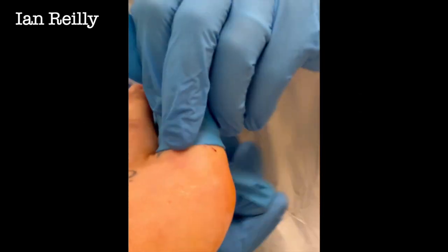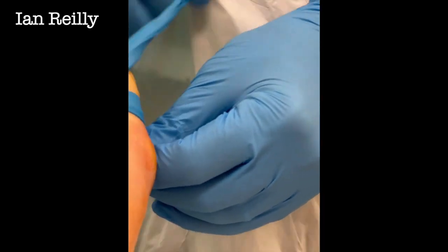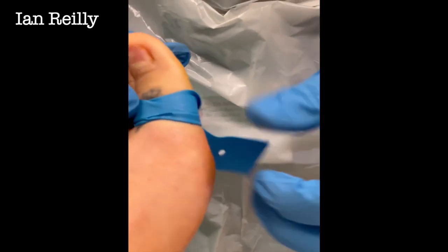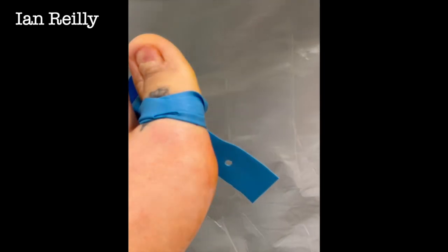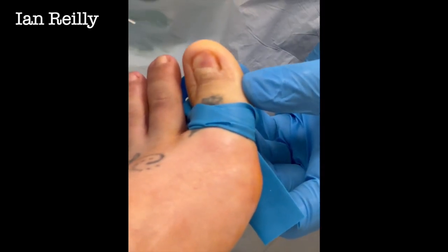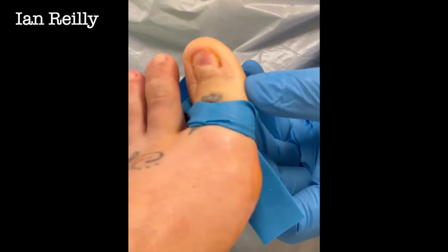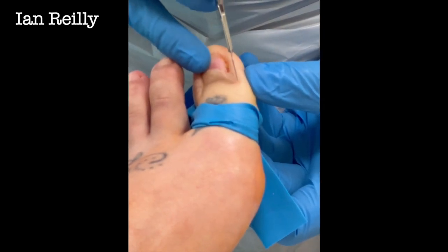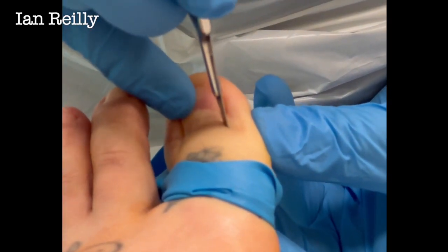We've already prepped the skin before the local anesthetic and re-prepped just then, so she's nice and clean. It's been a clean wound — not infected, just been sore for a few years. I'm just going to test again — any sharpness at all? All nice and good. Our root will be coming back here. There's our previous scar, so you want to make sure you're coming back far enough. Tip the blade in.